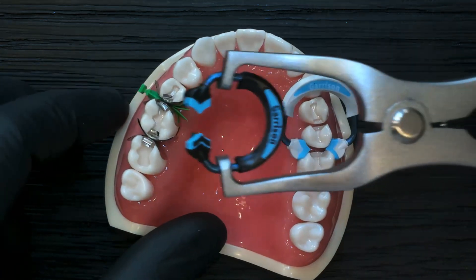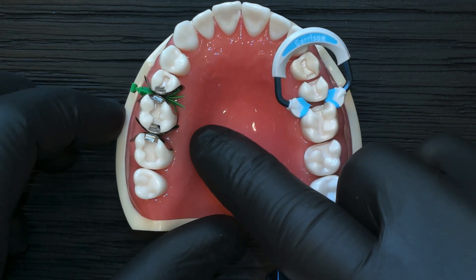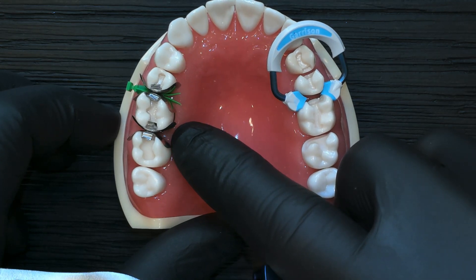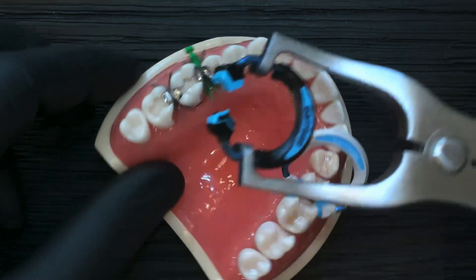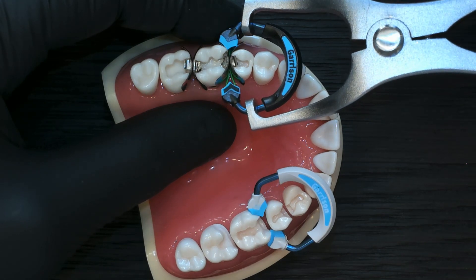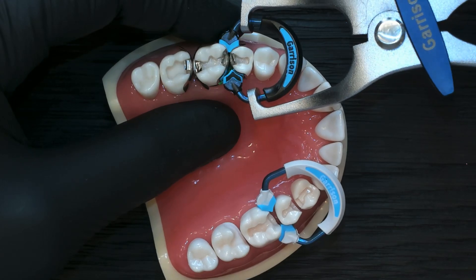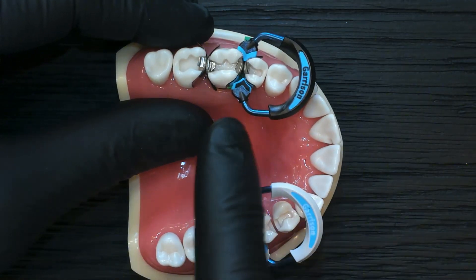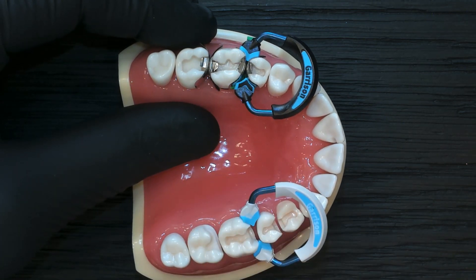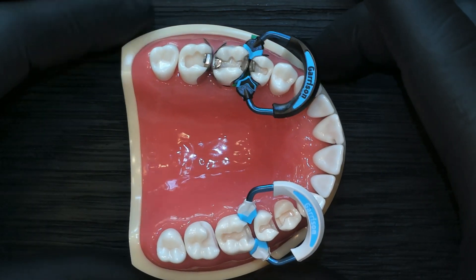With the quad, our goal was to focus the energy of the ring right down the middle to achieve enough tooth separation to accommodate both matrix band thicknesses, so when we remove them we're not left with a small gap. The driver tip engages the splitting wings of the quad wedge, forcing all the ring force right down the plane of the two teeth for maximum separation.